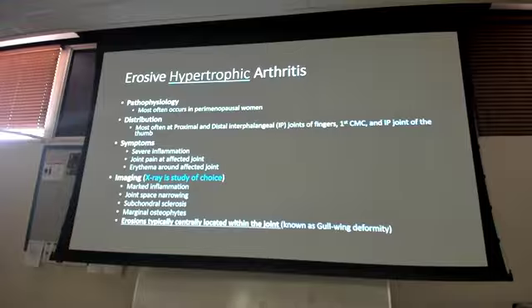So if your physical exam is showing erythema around the affected joint, you can probably rule out osteoarthritis at this level here. X-ray is your study of choice. You're going to have marked inflammation, joint space narrowing, subchondral sclerosis, and osteophytes. Well, crud, that's all the stuff we just talked about. Thanks for giving me all the exact same x-ray findings that we just talked about. Except this one's going to have erosions centrally located within the joint, which gives you what's called a gull wing deformity.